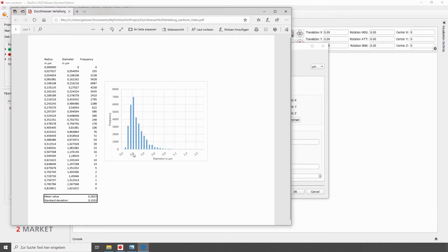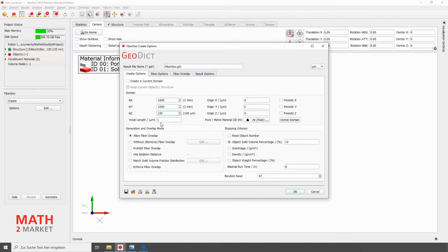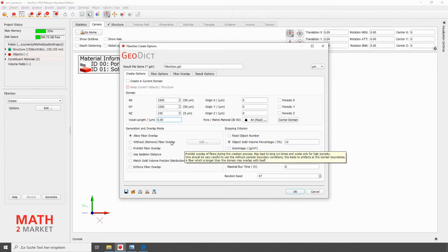Since we want to model this large peak of fibers well, we choose a voxel length of 0.05 micrometers to ensure that most of the fibers are resolved with at least 4 voxels. This results in a total size of 50 by 50 by 5 micrometers, which we want to model. In this window, we can also define whether the fibers should be generated with or without overlap. Since our fibers are produced by electrospinning, we can allow the generator to produce the fibers with overlap.